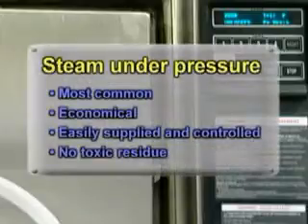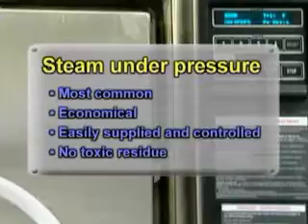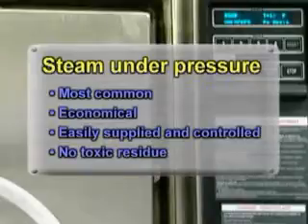Steam under pressure is still the most commonly used and economical method of sterilization of heat-tolerant items used in the operating room. It is easily supplied and controlled. Steam does not leave any toxic residue.